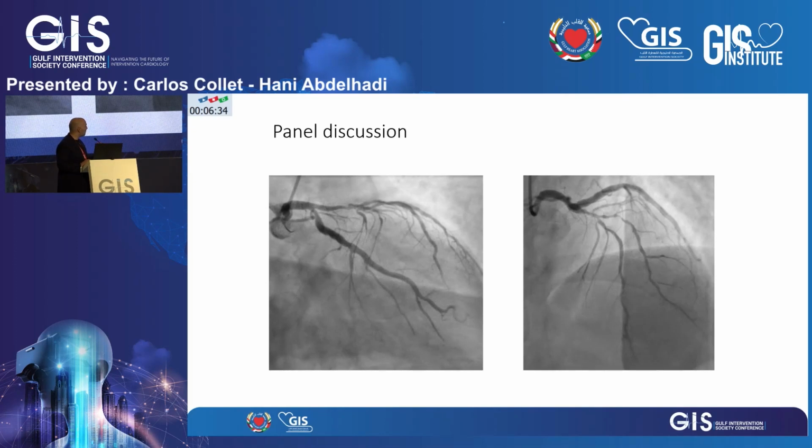Well, there is a moderate disease in the proximal left circumflex, and the LAD is severely diseased from proximal, involving the first diagonal as well. There's a bifurcation in the LAD with a severe stenosis in the proximal LAD. The circ from that view, I think it's moderate, 50%, followed by maybe an aneurysmal left circumflex from what it looks like here.